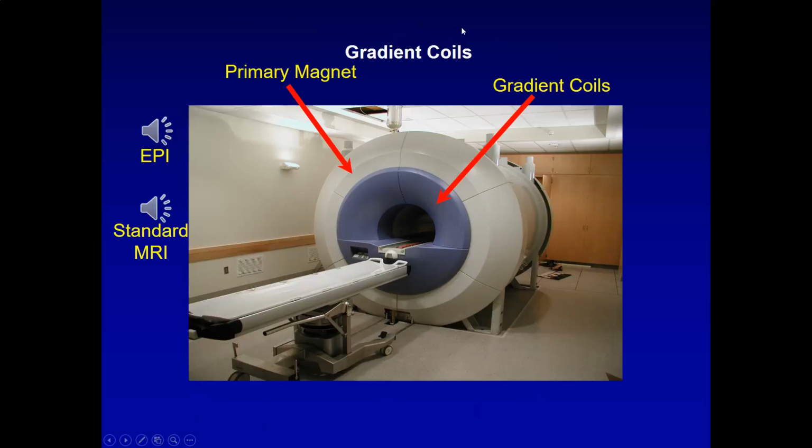We've described that there are forces, very powerful forces, that are exerted when electric current goes through the gradient coils. So here is our 4 Tesla magnet. Out here is mainly where the B0 coils are located. There's an insert behind this plastic cover. That's where the gradient coils sit. So they are sitting in a magnetic field of 4 Tesla.